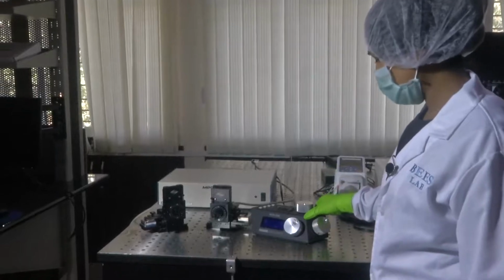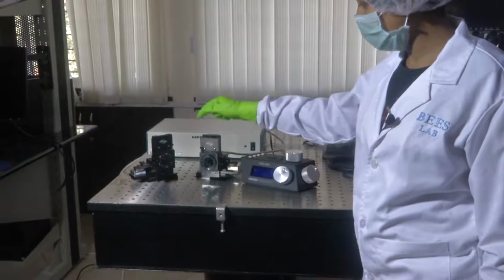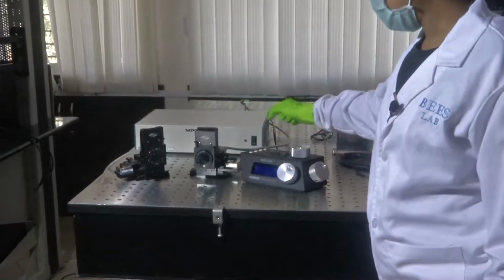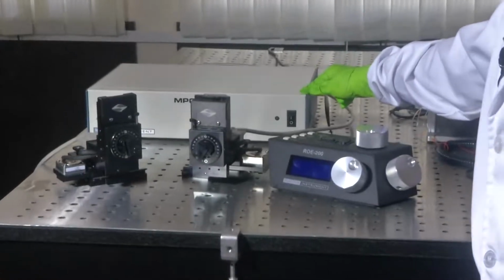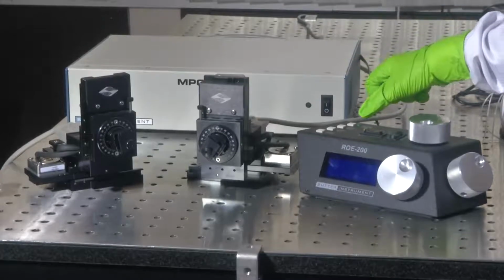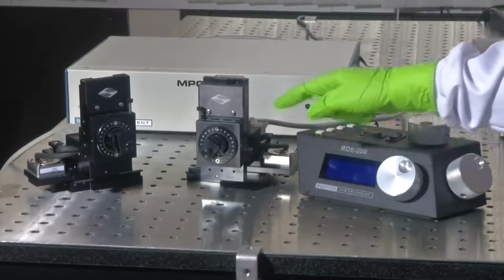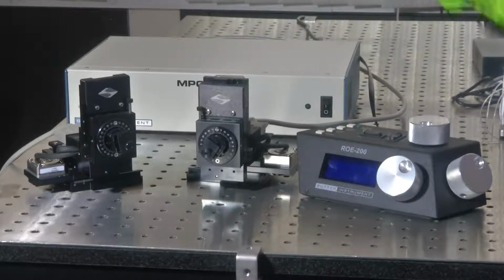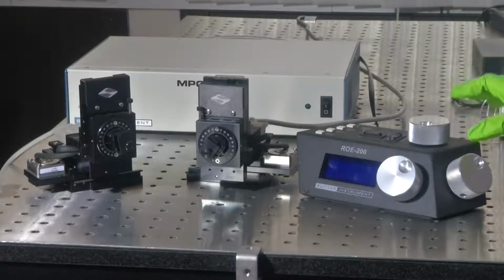This forms the control unit, and these are the two arms of the manipulator, and this here is the main unit which connects the control system and the manipulators. In our case, we have two here. So, let us see how each of these can be used and how they are integrated all together.